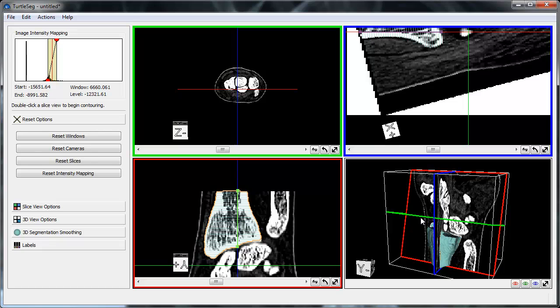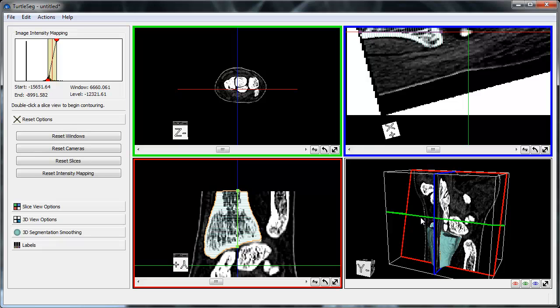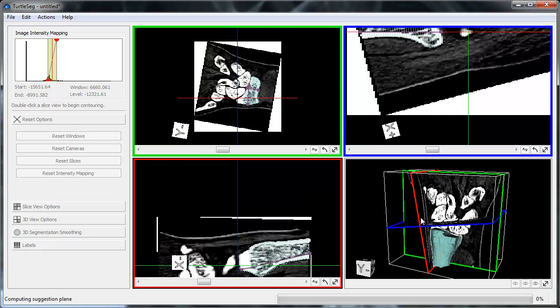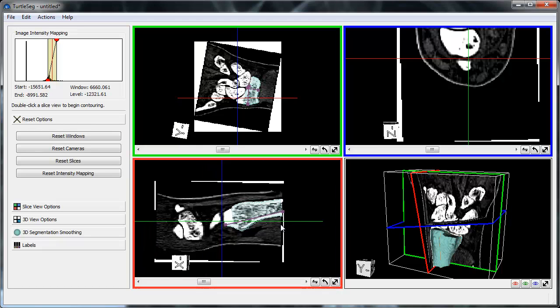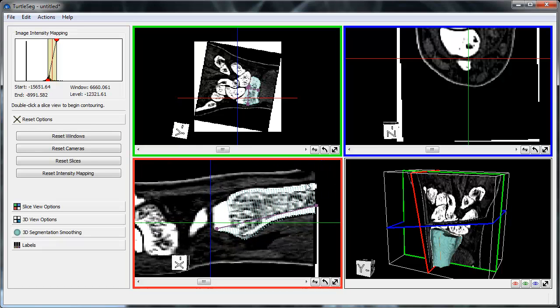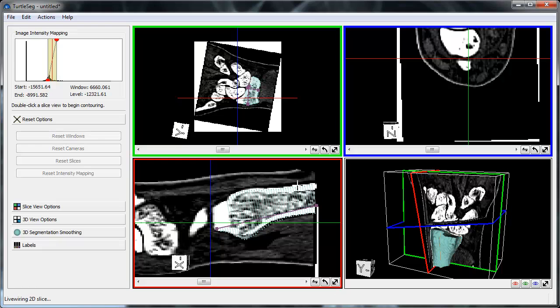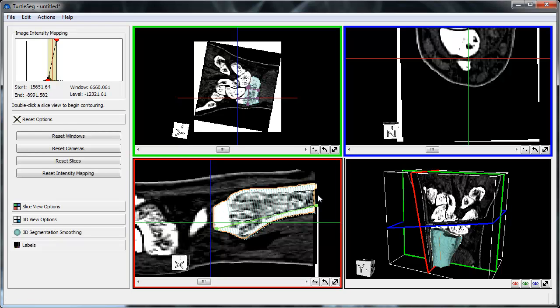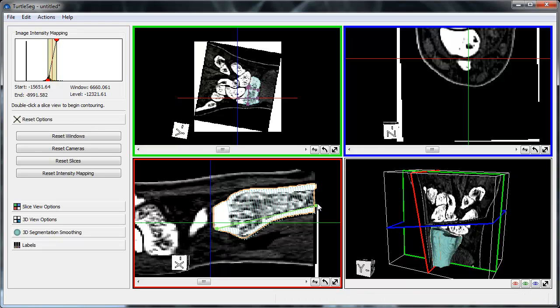So with the goal of adding a new contour, we ask TurtleSeg to suggest a plane for us again, this time using the keyboard shortcut Ctrl-G. The red bottom left slice view is realigned to the suggested plane, and so we contour the object within this slice. Now that this is complete, we rebuild the 3D segmentation using the keyboard shortcut Ctrl-B.